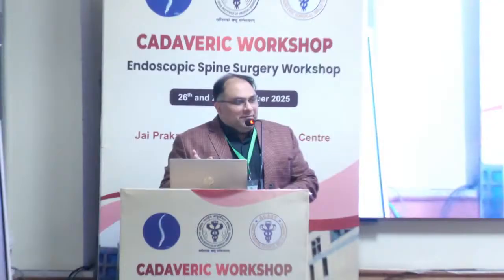As we do a laminectomy, they have done a one-sided laminotomy and over-the-top decompression to reach the opposite side of the foramina. But still you don't handle the cord, you don't handle the roots, and at that time you don't go for the disc and remove it. It is indirect decompression from the outside. That's it. But still, many things can happen. If you don't maintain the alignment and you only do the two levels, the cord can get bowstringing through the anterior compression and posterior compression. So you have to select your cases very well.